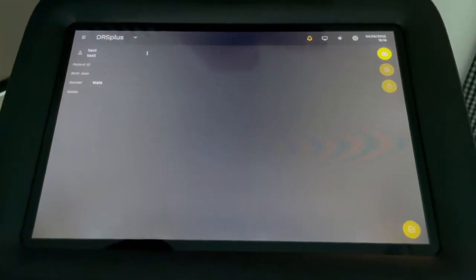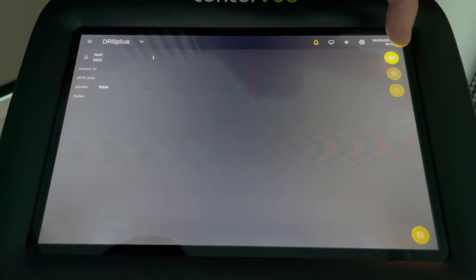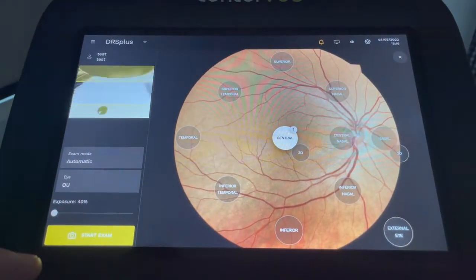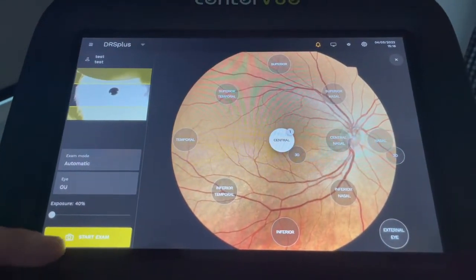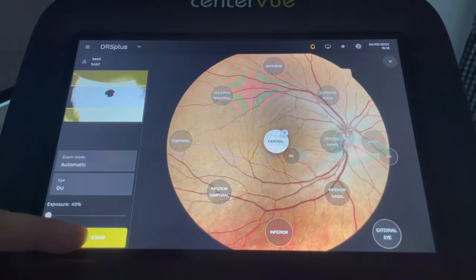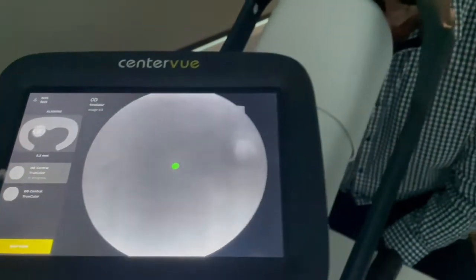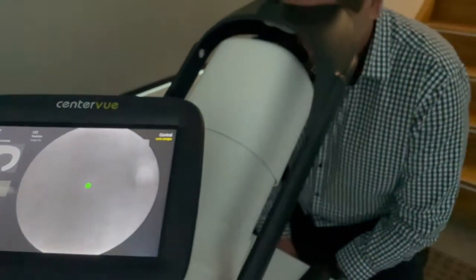To start the exam, press the button here. Press the start of the exam, and then we're going to do it again.